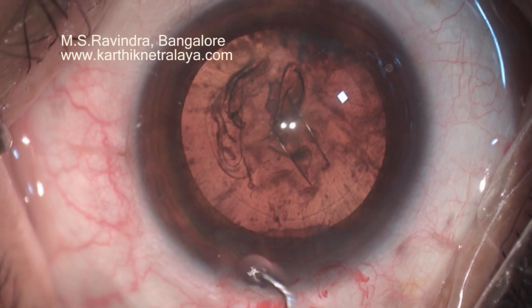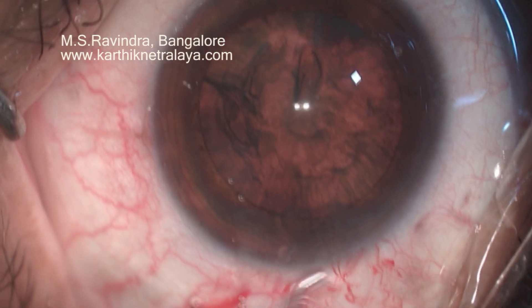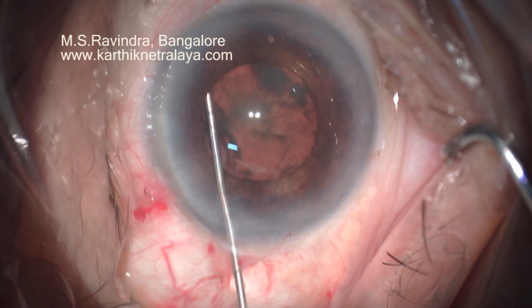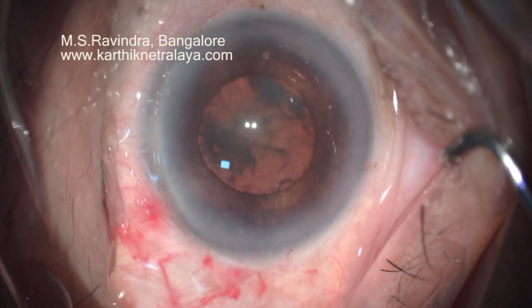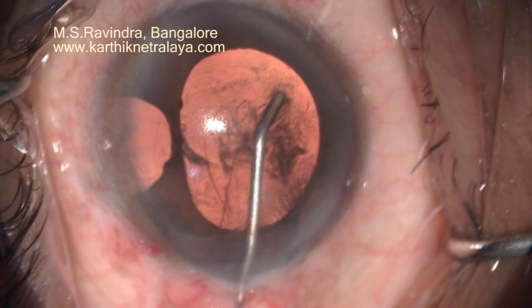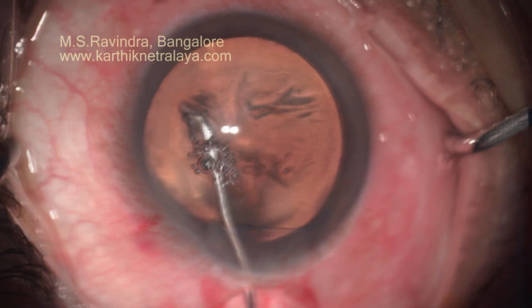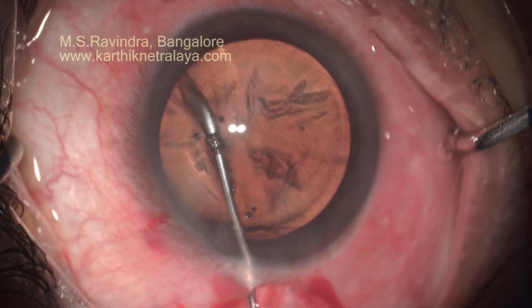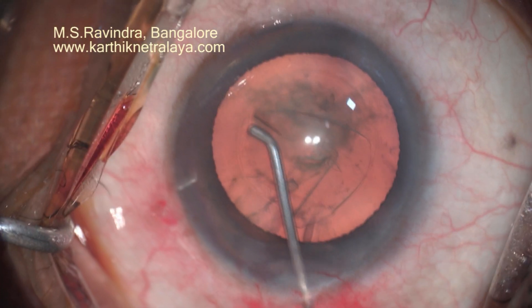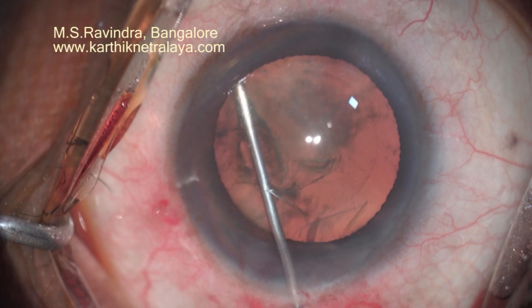This has been seen periodically. Whenever you are doing hydro-dissection, ensure that the tip of the cannula is directed towards the equator but positioned under the anterior capsule edge, lest it go in front of the anterior capsule. Even the slightest pressure of injection of balanced salt solution can reach through the zonules into the vitreous cavity, and intraoperative hard eye is often seen — unexplained — but this has happened because of fluid misdirection into the vitreous cavity. One has to be extremely careful, especially when the AC is being deepened with any technique, to ensure that the fluid wave is not directed between the anterior capsule and the iris towards the zonular apparatus.